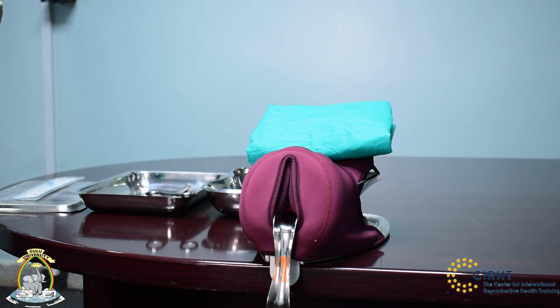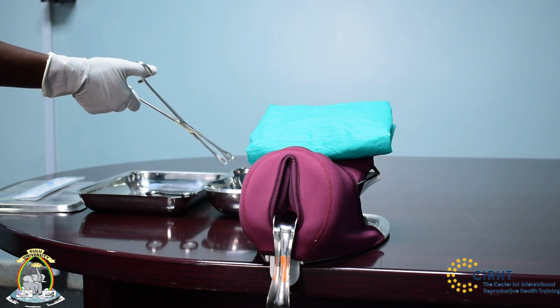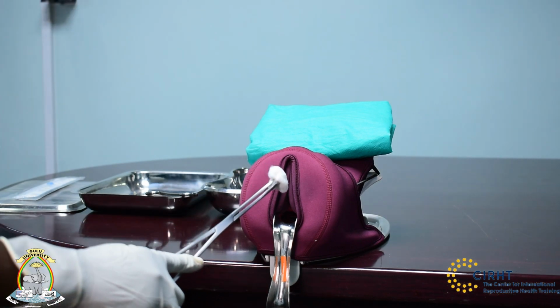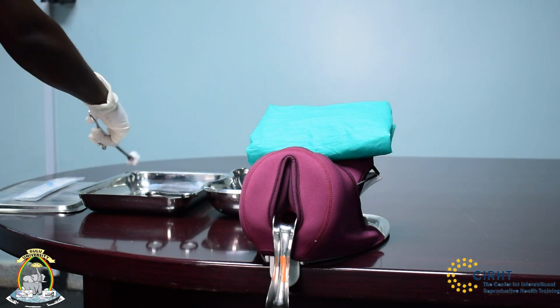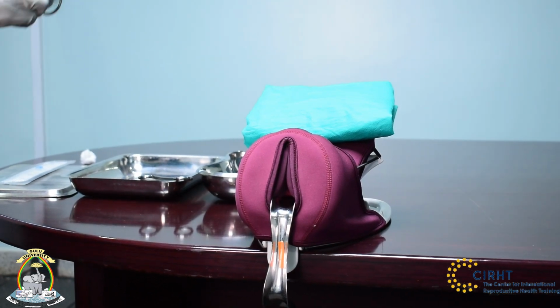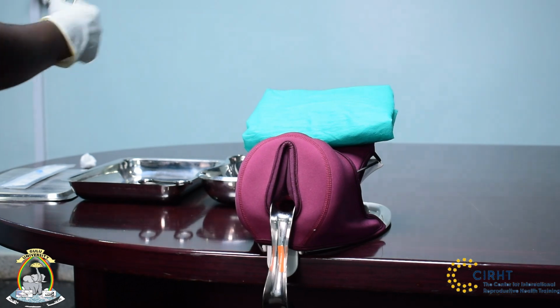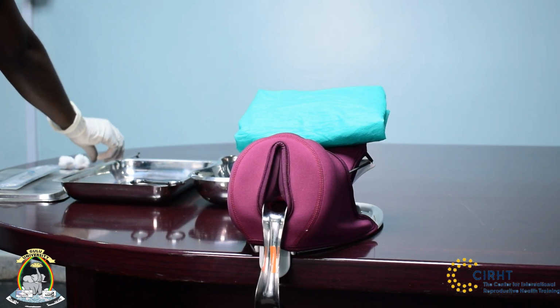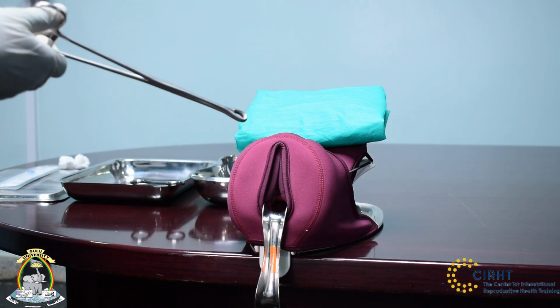And then we are going to go ahead and clean the cervix and the vagina with antiseptic solution. So this is our piece of gauze with antiseptic solution in it. So we shall clean the cervix and the vagina. And discard. We are going to do this twice. As we come out, and since that is done, we shall set our sponge holding forceps aside. And then we are going to use our sponge holding forceps to gently grasp the anterior lip of the cervix.